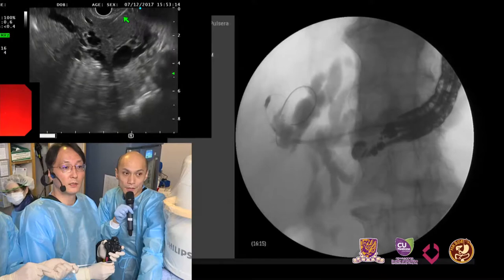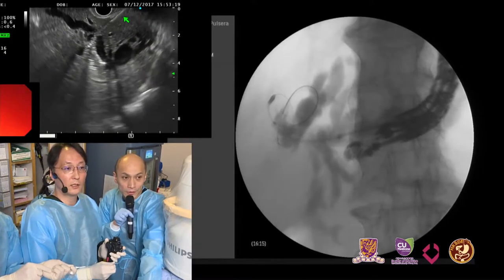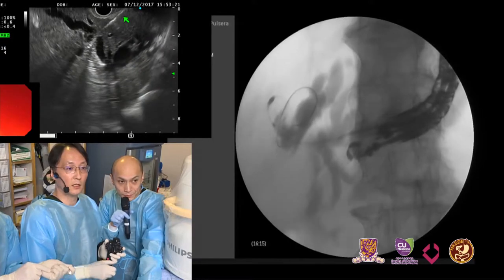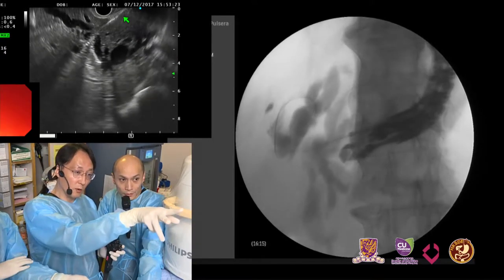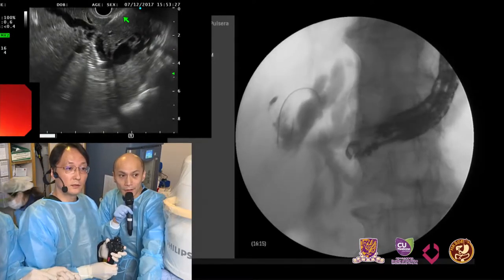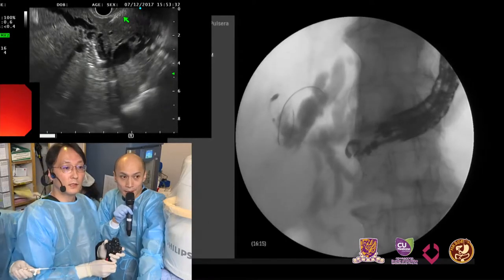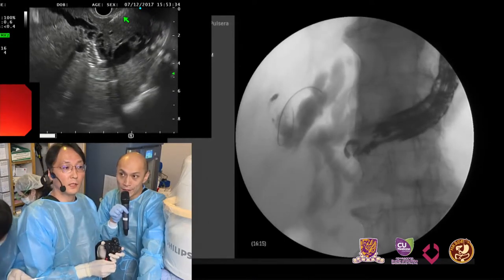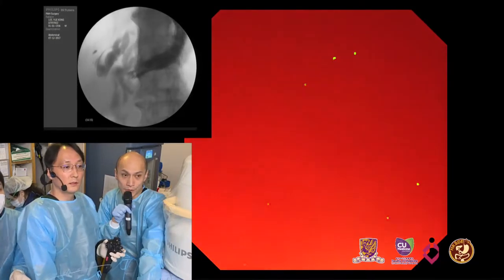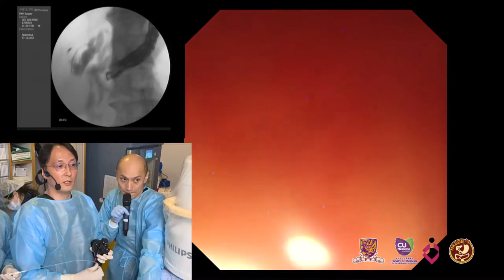Okay. So is there an uncovered portion? Yeah. Can you slow it down a little bit? Show us the uncovered portion. Yeah. This uncovered portion is 1.5 cm. Okay. So if you can see it, there's a mark on X-ray in the distal part, close to the end of the stent, showing the uncovered portion, and this helps to maintain the position of the stent. Yeah, then the stent is fully deployed.